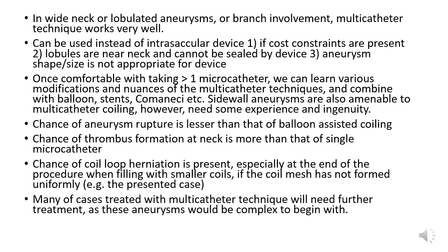Side wall aneurysms are also amenable to multi-catheter coiling. They are slightly more advanced. I would say they need some more advanced techniques of the multi-catheter technique, but they do very well. I'm doing that.